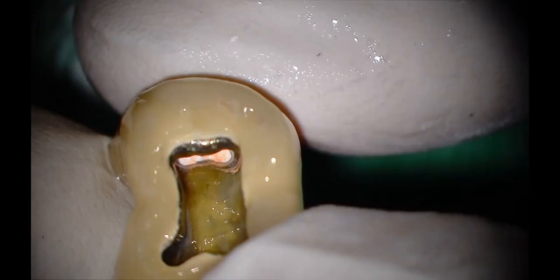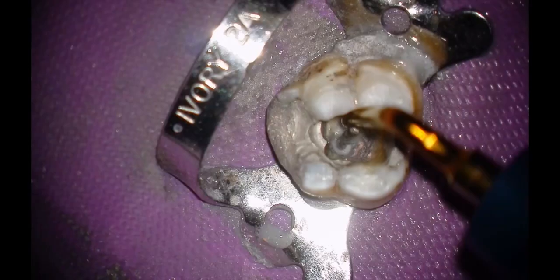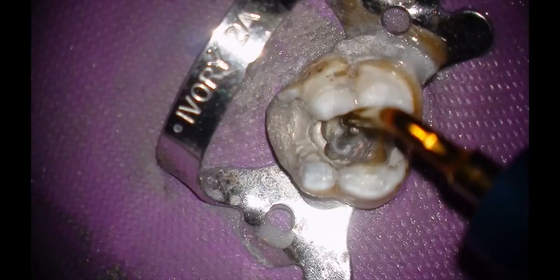The Ultramint and Ultramint Pro ultrasonic systems are extremely versatile instruments that can easily take your practice to the next level. Join the revolution!